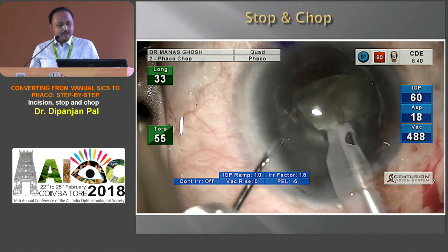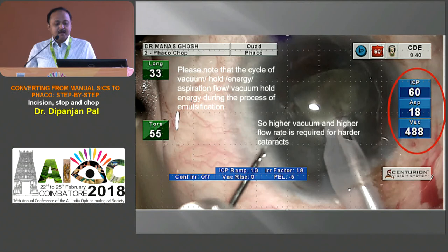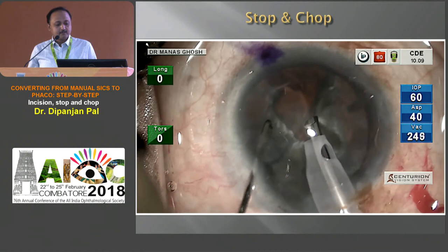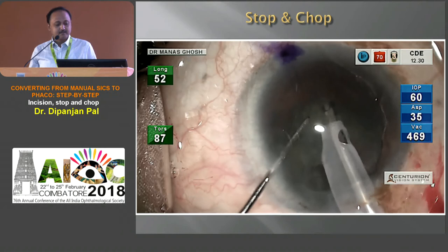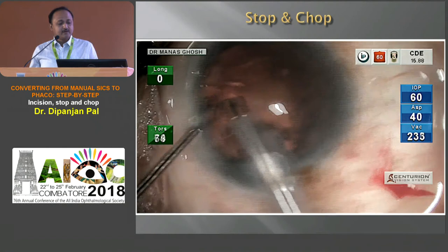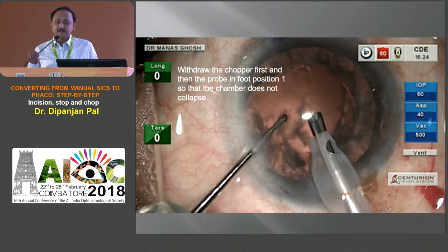For emulsification, the vacuum has to go up, aspiration flow rate has to go up, and we have to note the cycle of vacuum, hold, energy, and aspiration flow rate during the whole process of emulsification. Higher vacuum and higher flow is required for harder cataracts. Step by step, we remove the nuclear parts — depending on the hardness, we can make four to eight parts of the nuclei. Be careful when finishing — don't remove the FACO probe suddenly, because there is sudden loss of chamber which can injure your rhexis and also your posterior capsule. So withdraw the chopper first and then the probe in foot position one, so the chamber is never lost.